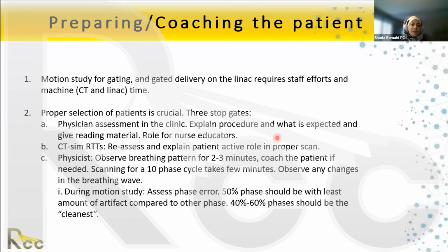And it starts with the CT SIM therapist talking with the patient: do you understand what we're going to do? We're going to ask you to breathe normally, no sudden moves, try to keep and maintain a nice rhythm of breathing. And actually, once you start talking to patients like this, they start forcing themselves to do a yoga-style breath, right? No. Breathe normally. Just be mindful that you don't do anything sudden, or take quick breaths, or take longer breaths.